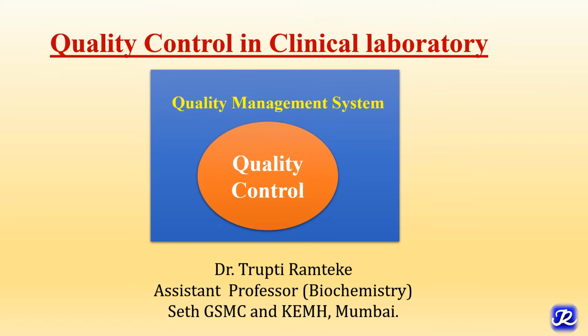Hello everyone. Today we are going to study a very important topic, that is quality control in a clinical laboratory. Quality control is one of the important aspects of total quality management system in a clinical laboratory. And the main emphasis of quality control is to monitor precision and accuracy of performance of analytical methods.